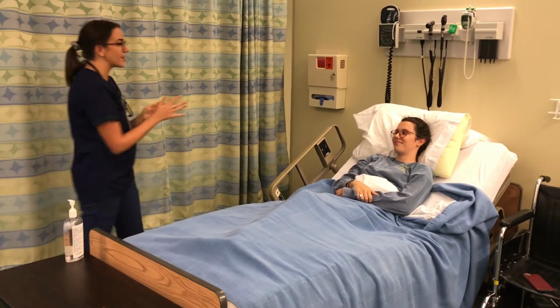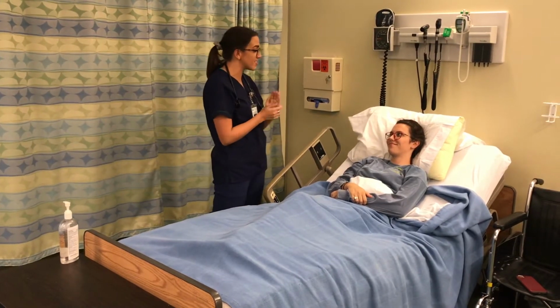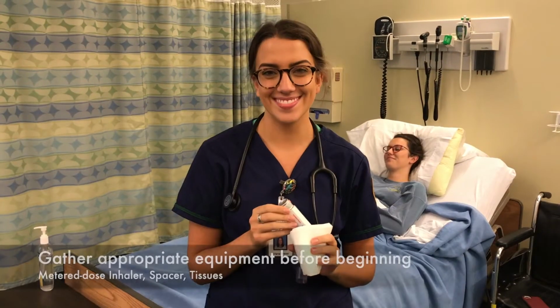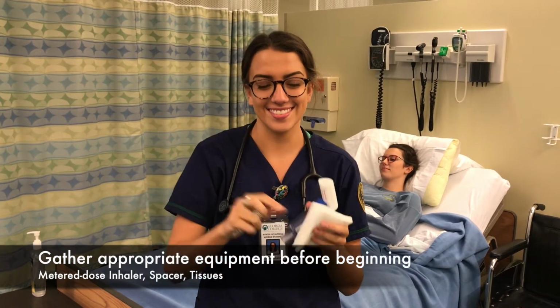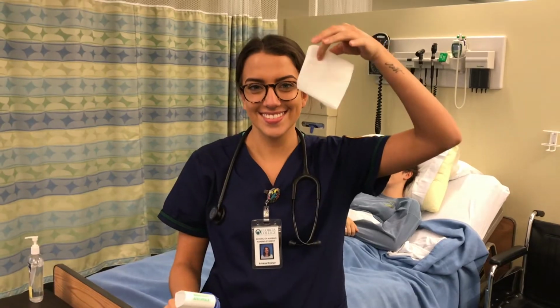My name is Ariana and I'm going to be your nurse today, and I'm just going to be administering some inhaled medication for you. The supplies needed for today are metered dose inhaler, spacer, and tissues.